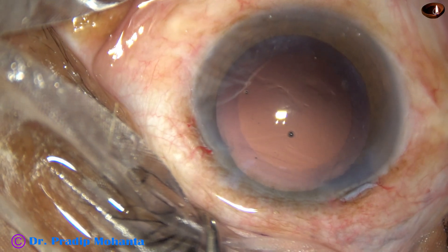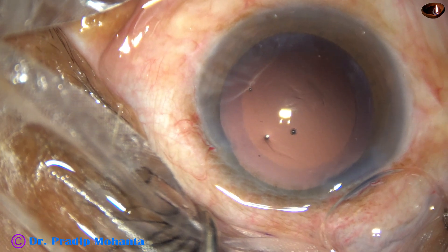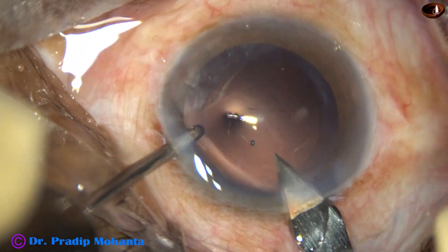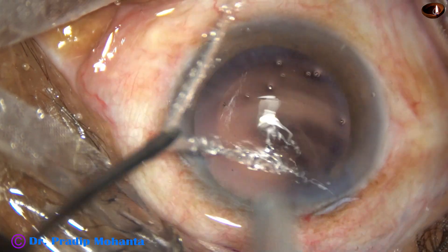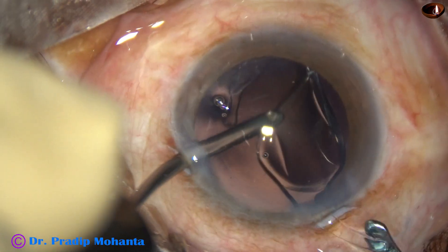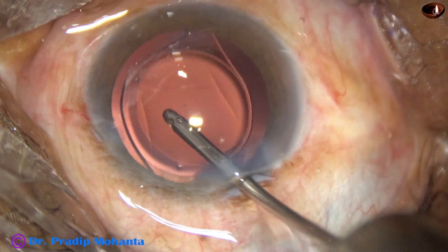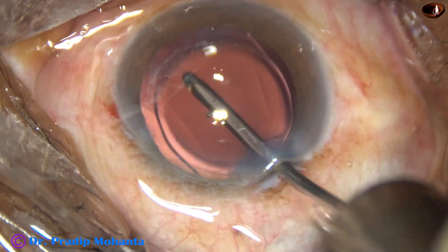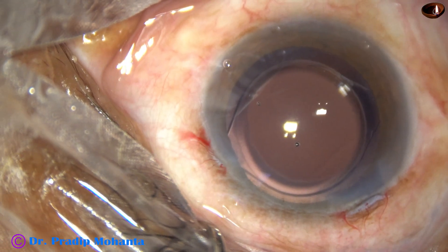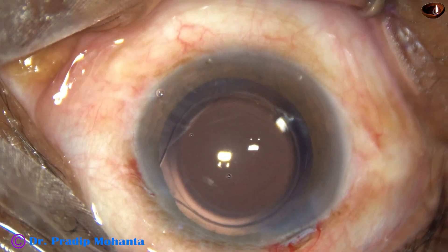Cortical cleanup has been done and now the intraocular lens is to be implanted in the capsular bag. This is hydro-polish. In this case, I am going to use a B cartridge, so I need to enlarge the main wound a bit — just one cut. The B cartridge does not cause compression of the optic, so in intraocular lenses where the dioptric power is high, say about 25 or more, it is better to use a B cartridge. You can see a nice overlap of the optic of the intraocular lens all around by the anterior capsular rim. The size of the rhexis is ideal — about 5.25 to 5.5 millimeters in this case.